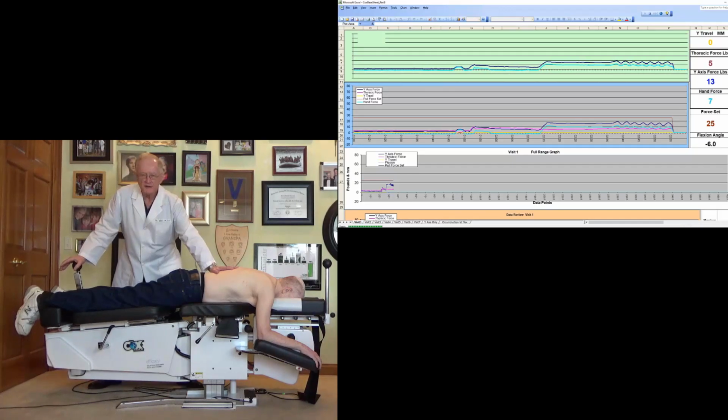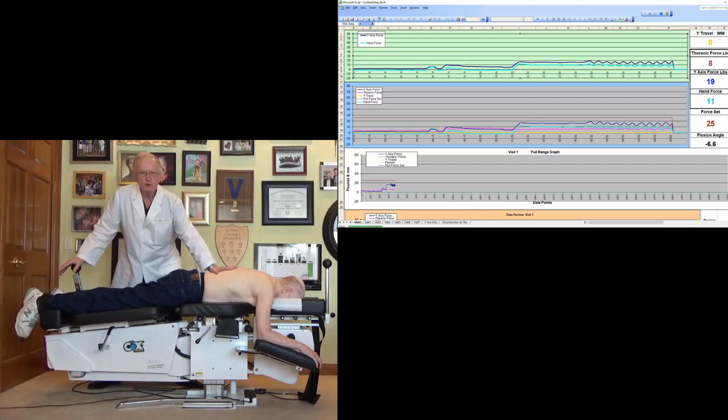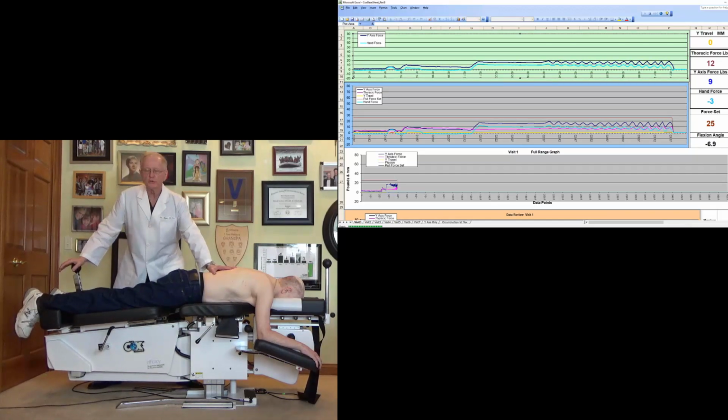The closer you make these two to equal, but the dark blue slightly more than the light blue, is the force of flexion distraction. That's 2 pounds. This will give, in our findings, good clinical outcome without over-distracting and causing any adverse effects for the patient. So we start with 2 pounds.